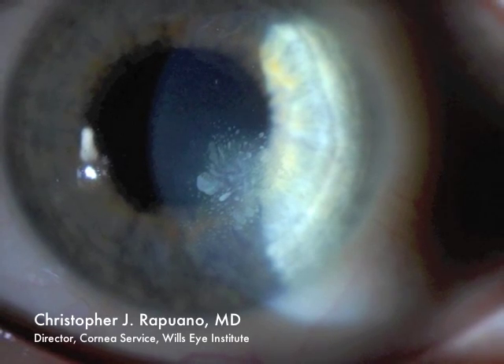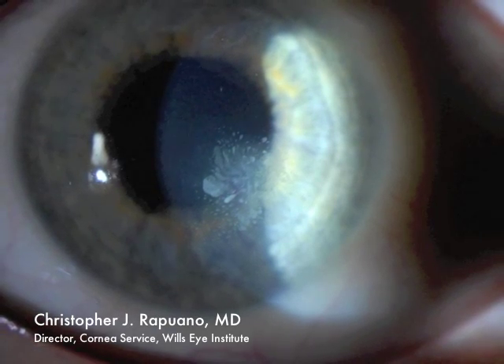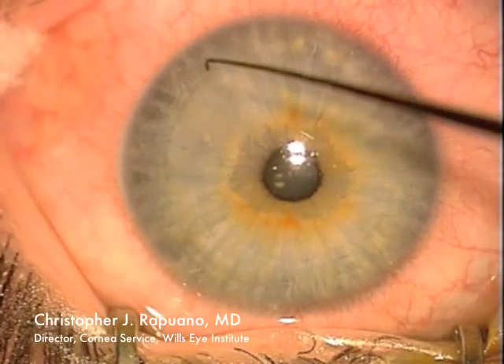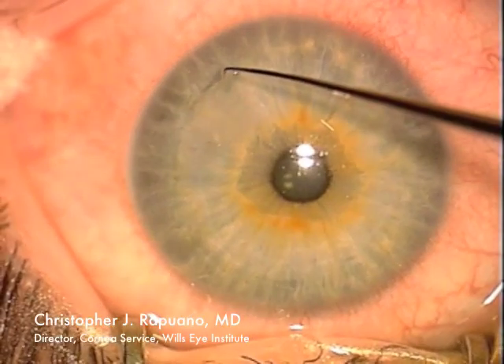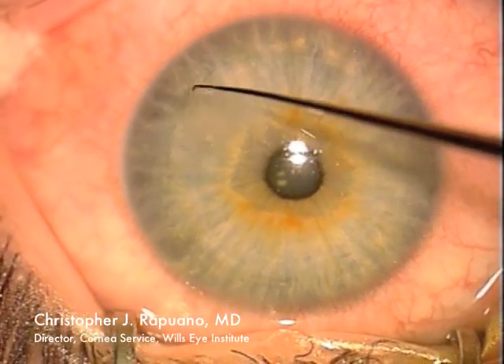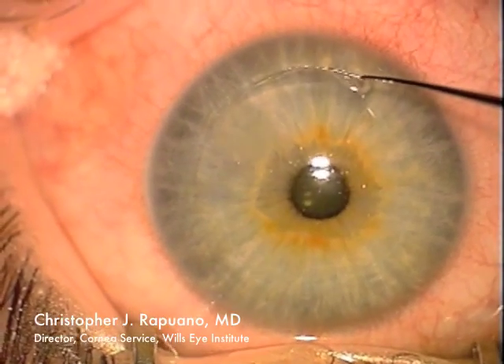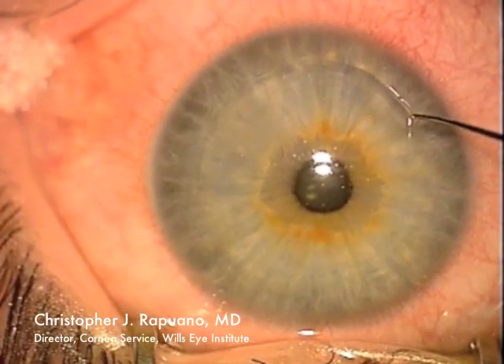The cells are entering the visual axis and causing damage to the flap, requiring removal. In surgery, I first identify the area where the cells are most involved, which is at the upper left-hand part of this video. I very easily open up the edge of the flap because there is significant epithelial ingrowth preventing good flap adherence.